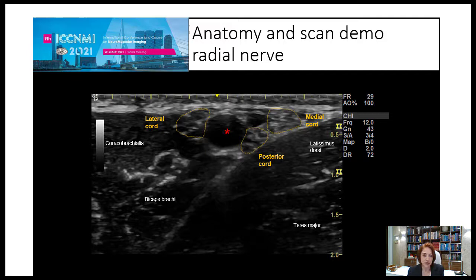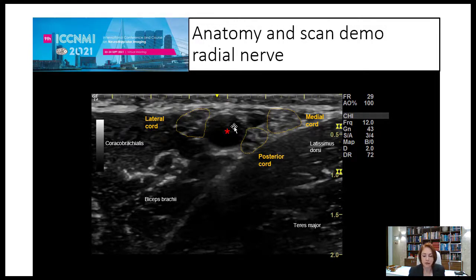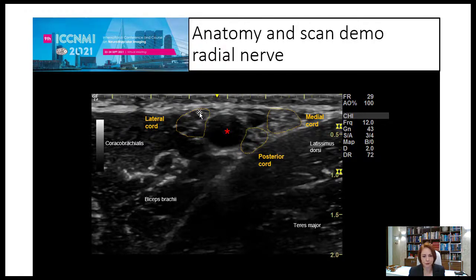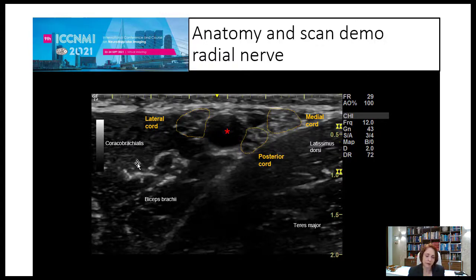Here in the armpit, you can see the axillary artery. The veins are not visible because they are easily compressed — I prefer to image with slight compression without the veins due to posterior enhancement. You can see here the lateral cord, the medial cord, and the posterior cord. This is a very good image, and you can also see muscles as landmarks.